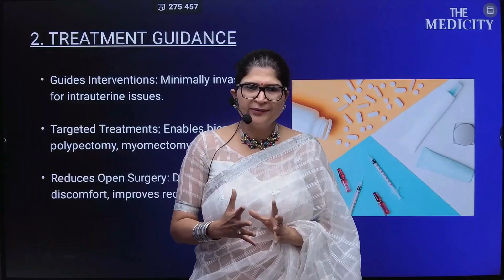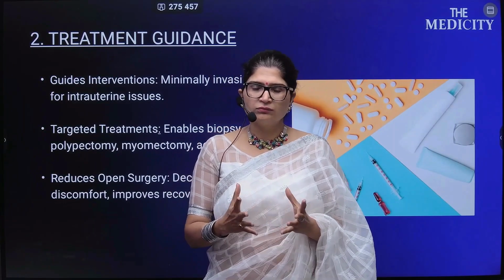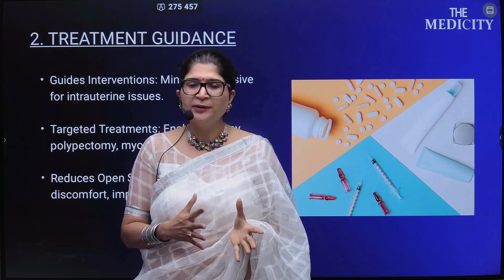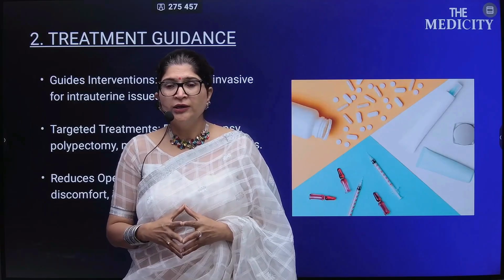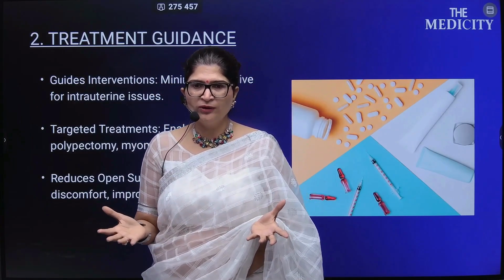About treatment: as we have already discussed, it's a minimally invasive treatment done with the help of the hysteroscope. Targeted treatments enable biopsy, polypectomy, myomectomy, or adhesiolysis. The chances of open surgery decrease, reducing discomfort to the patient, improving recovery, with less hospital stay, less cost burden to the patient, and less hospital investment for a particular surgery.